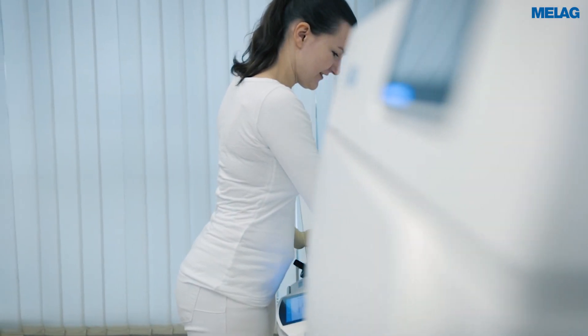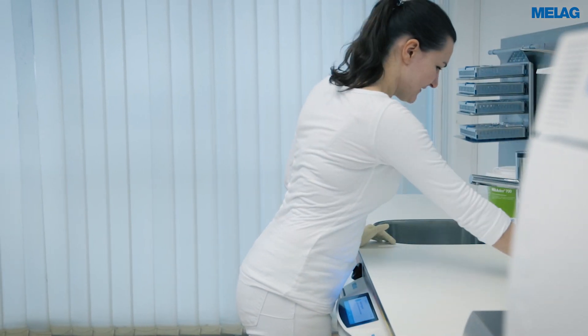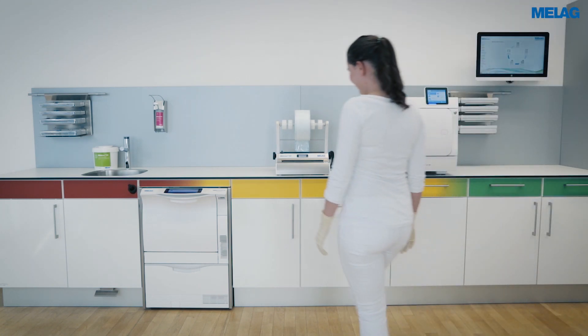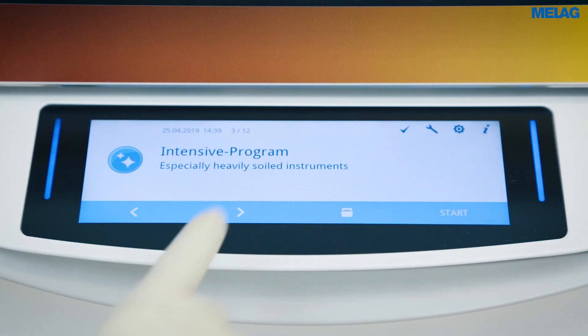The high-performance Miele Thermo 10 Evolution allows non-stop instrument decontamination processes. If the device was not used for two days or longer, it is necessary to perform the rinse program twice before starting instrument decontamination.